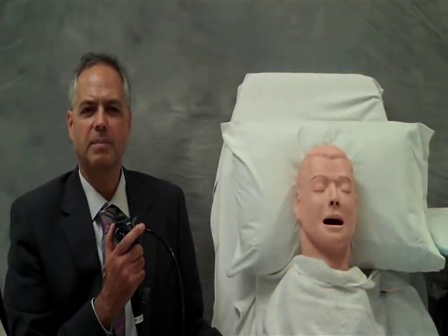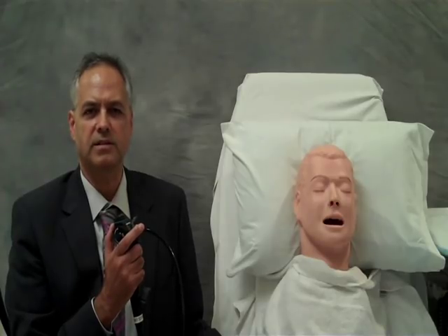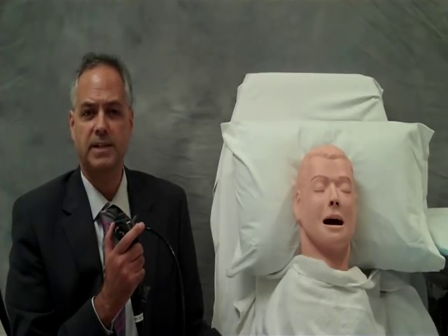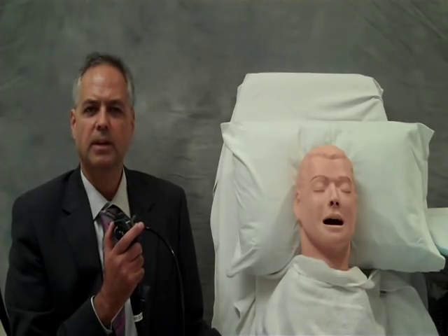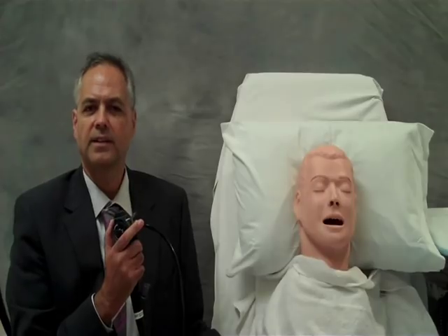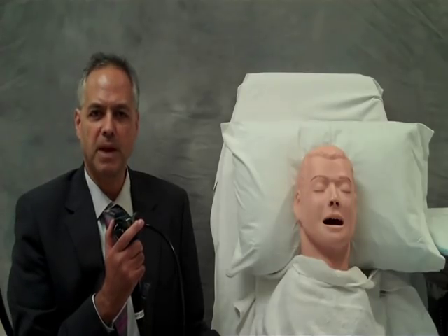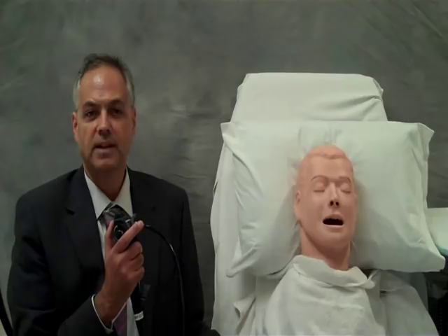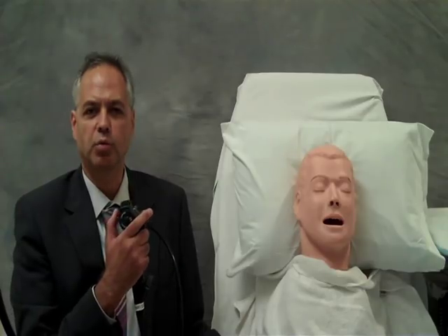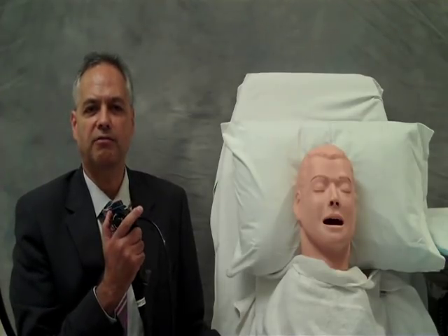My name is Henry Colt. Today my team and I are going to demonstrate a series of bronchoscopy step-by-step exercises. Just as one learns to play tennis or golf in stages, or learns to play a musical instrument step-by-step, one can also learn bronchoscopy using this systematic approach. We've deconstructed bronchoscopy into a separate group of exercises, allowing us to develop muscle memory and spatial awareness by identifying the appropriate lobar and segmental anatomy and learning to rotate the bronchoscope in an atraumatic fashion.